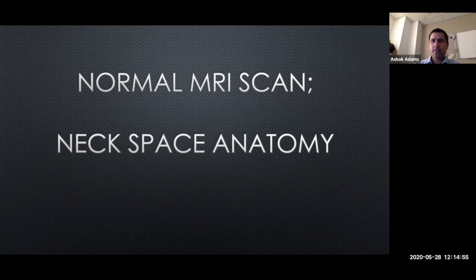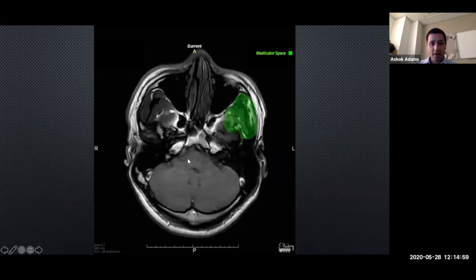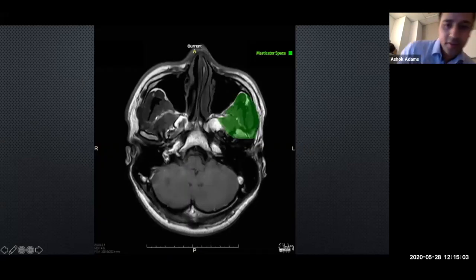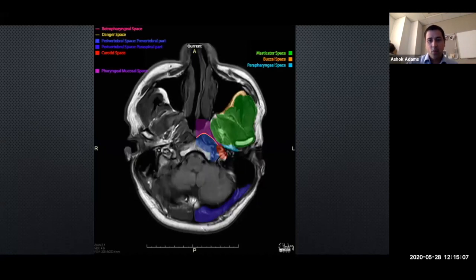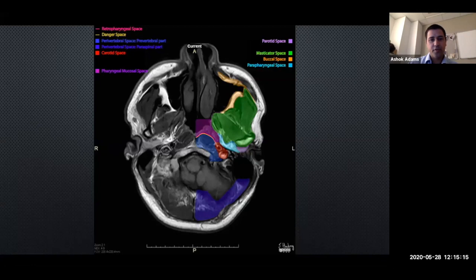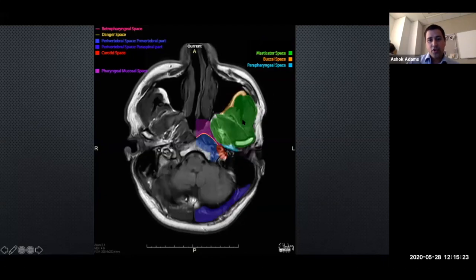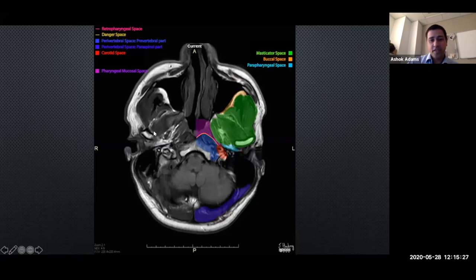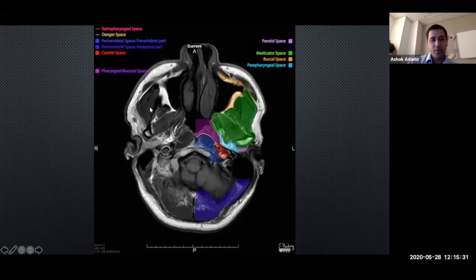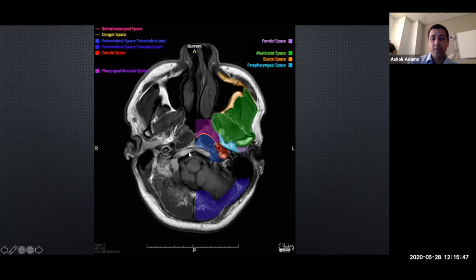Now the second part - how does that anatomy translate onto imaging? This is an MRI scan, a T1-weighted sequence. A lot of our juniors use Radiopedia right next to the scan. T1 weighted sequences give beautiful delineation of anatomy and most importantly a beautiful view of fat, which is bright on T1. This is particularly useful when looking at skull base pathologies because all the skull base structures will be full of marrow fat and therefore T1 bright.